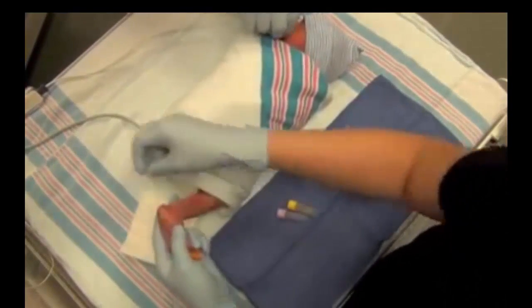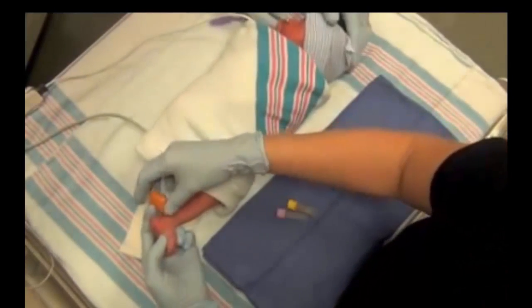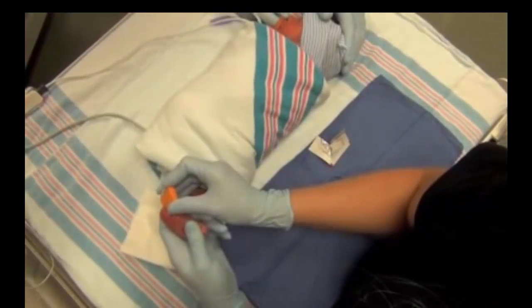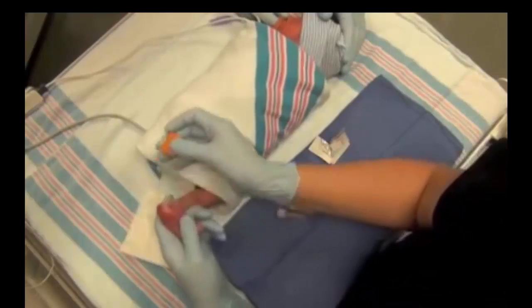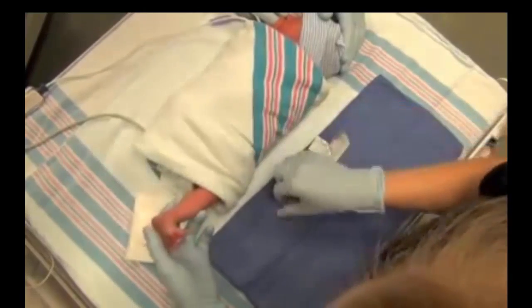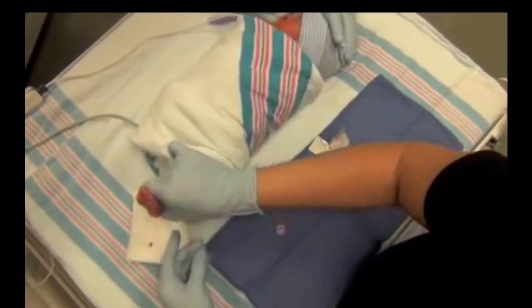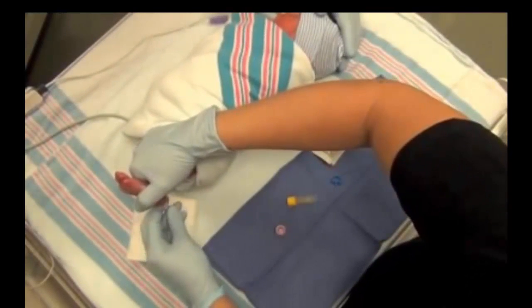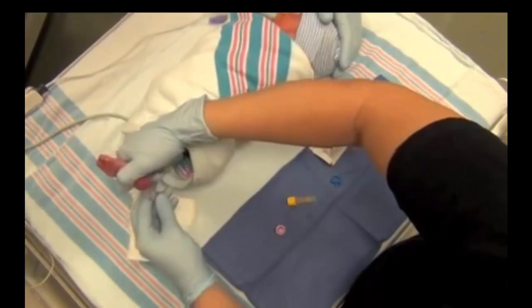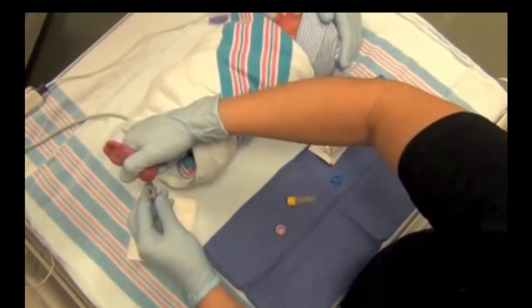An alcohol swab is being utilized to cleanse the future puncture site and the surrounding tissue. The appropriately sized tenderfoot lancet is being used to puncture the heel. The first drop of blood is wiped away with a piece of gauze. Subsequent blood will be collected for sampling. Please note that the infant is swaddled and additional sucrose is administered intermittently for continuous pain control.